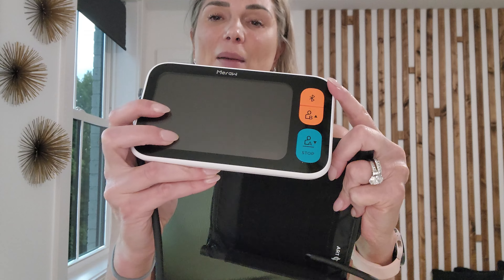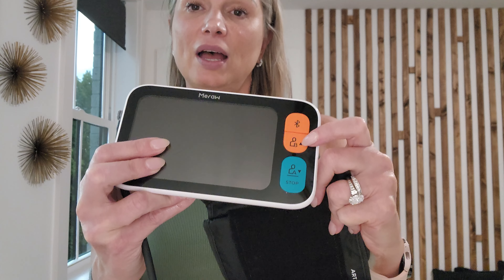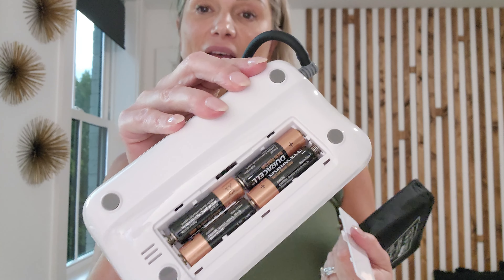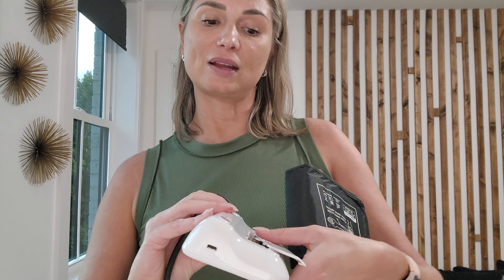Here is the blood pressure cuff and machine. As you can see, it has a digital screen and some buttons. It is Bluetooth compatible and has User A, User B, and a Stop button. This is where the air hose plugs into the unit. It comes with Duracell AA batteries, which is a big plus since you don't see that often. It also includes a user manual, a quick start guide, and a handy carrying case for travel.